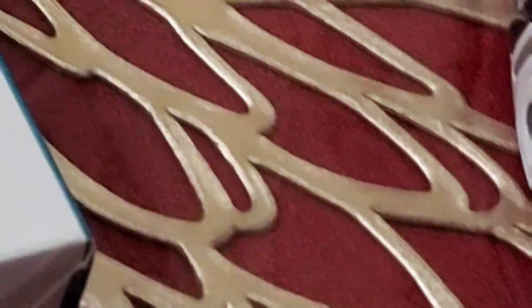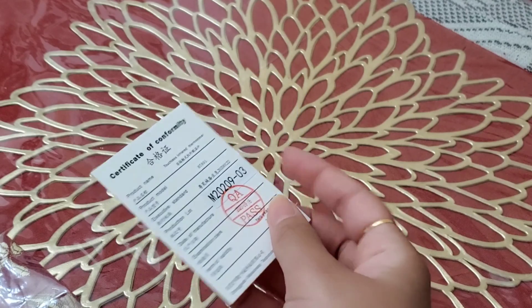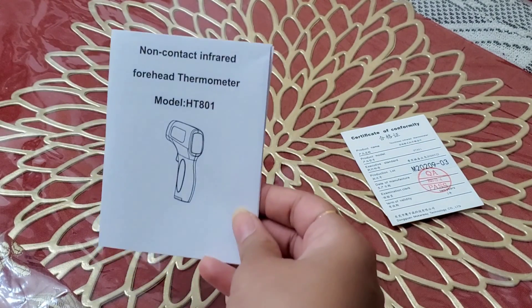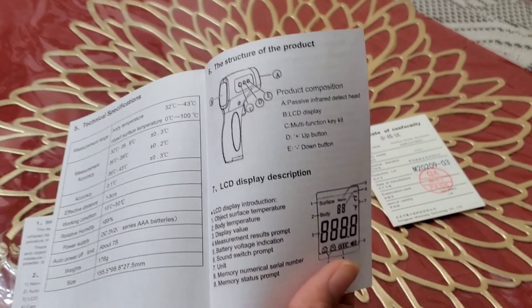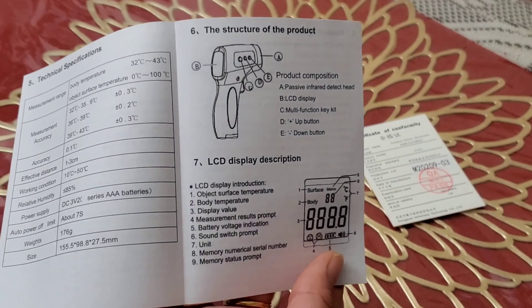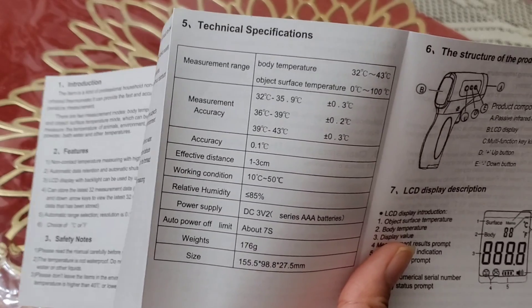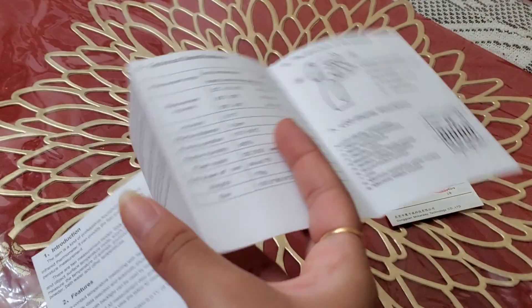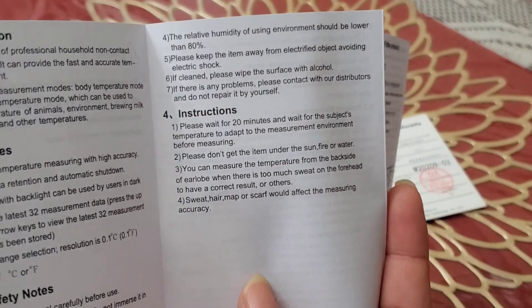First we have a certificate of conformity, which I believe is just something they include within the product. We also have the instruction manual — a very handy and short instruction manual. You can see all of the descriptions very clearly laid out here: the description and a display of what to expect from the product itself. This one includes what kind of batteries it needs, the relative humidity, the power supply, measurement range, and measurement accuracy — very knowledgeable information you should know.